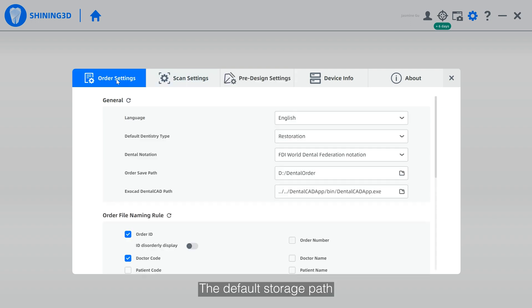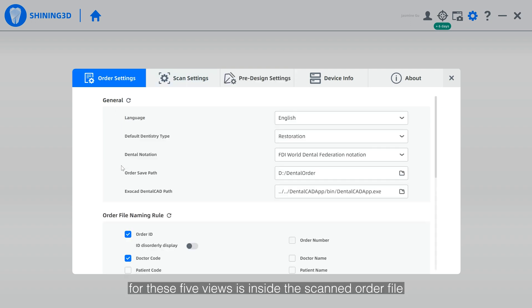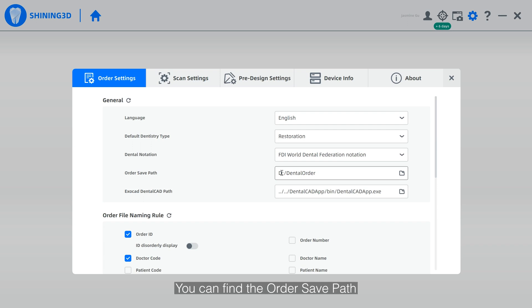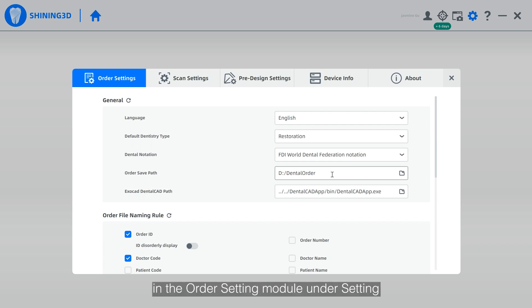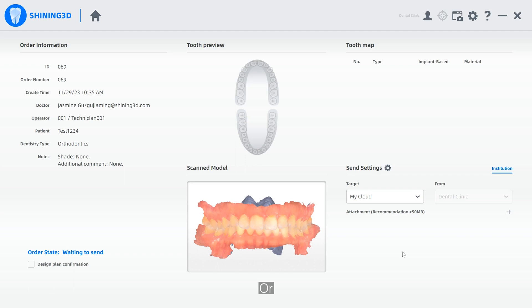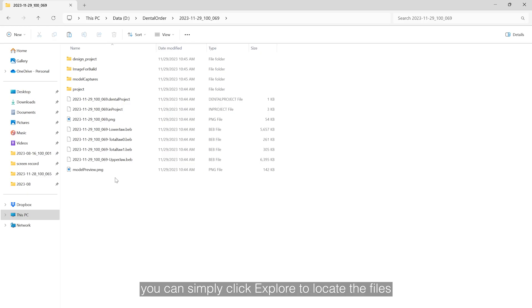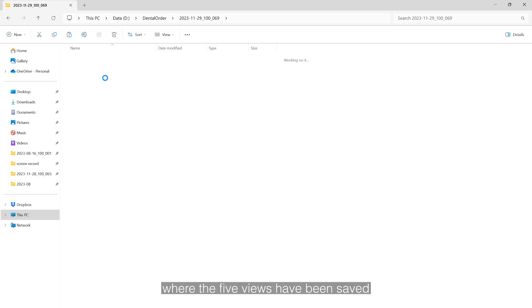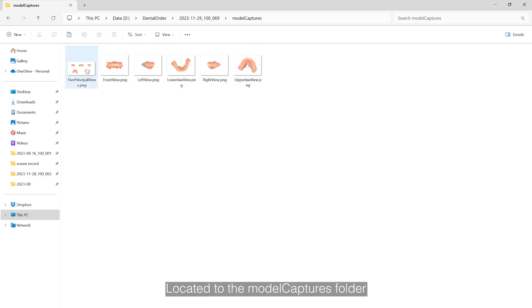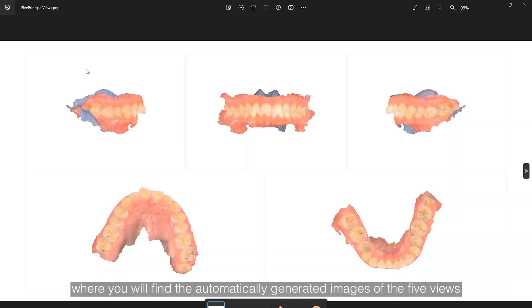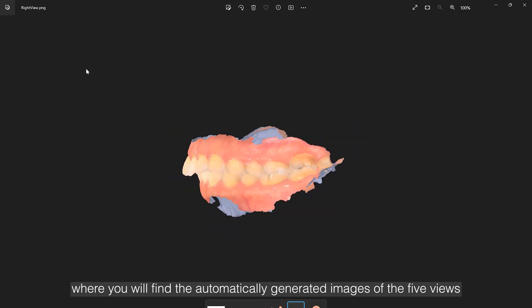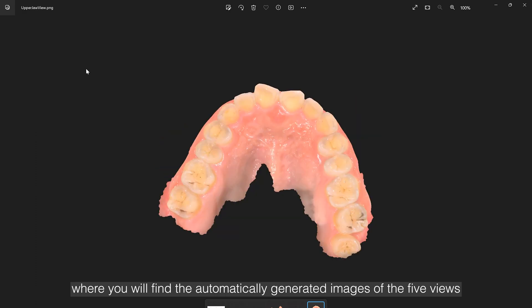The default storage path for these five views is inside the scan order file. You can find the order save path in the order setting module under settings, or you can simply click export to locate the files where the five views have been saved. Navigate to the module captures folder, where you will find the automatically generated images of the five views.